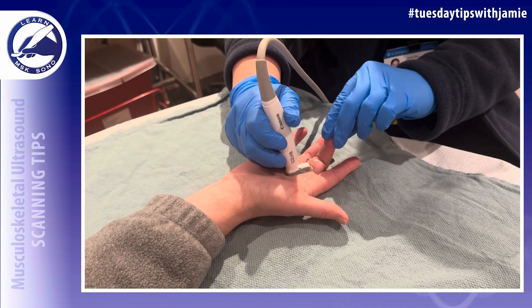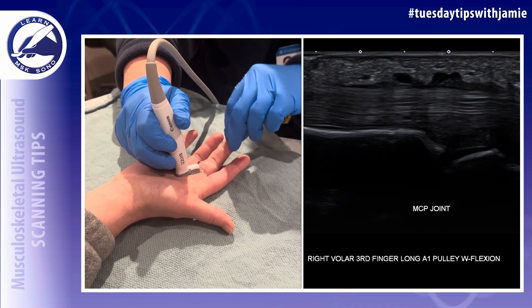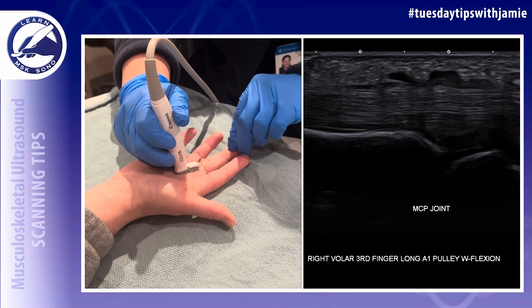In the first example, I was the one performing the finger flexion while scanning, and I did not see any restriction of the flexor tendons present during the dynamic evaluation.